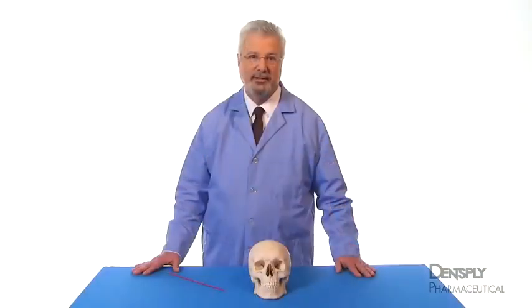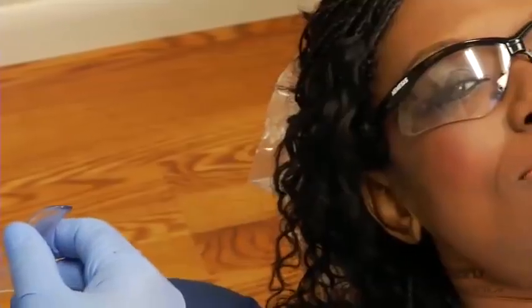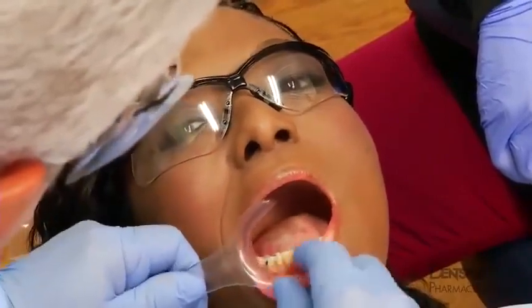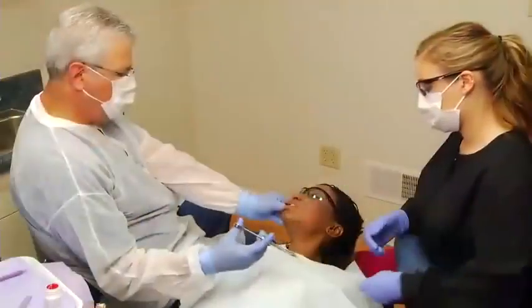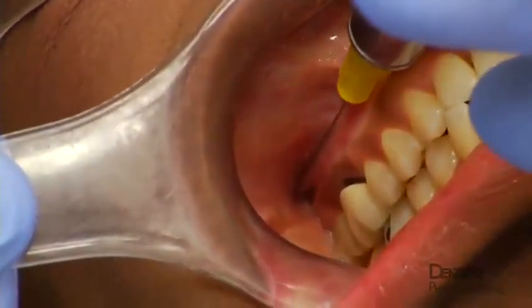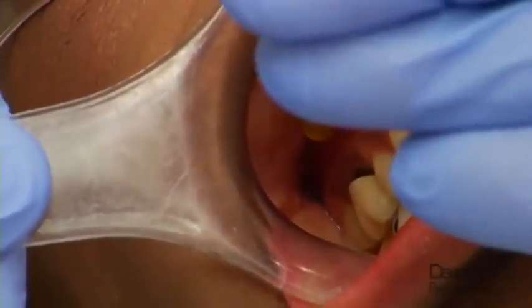The extent of intraoral anesthesia is similar to that of the Gow-Gates block. With the patient's head adjusted to facilitate visualization of the retromolar region, the cheek is retracted with the thumb to expose the insertion point midway between the ramus and the maxilla at the height of the mucogingival junction of the maxillary molars. With the syringe parallel to the occlusal plane, the needle is inserted posteriorly through the mucosa and buccinator muscle to enter the pterygomandibular space.